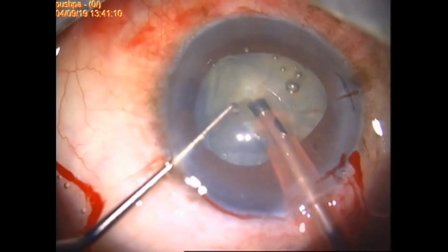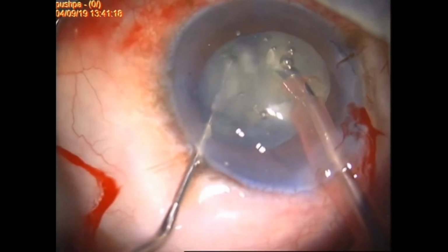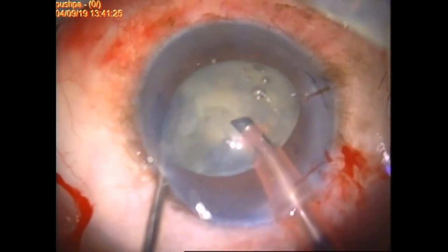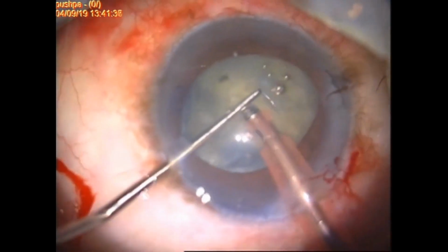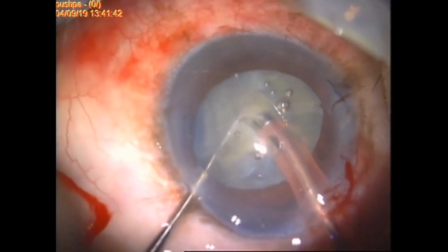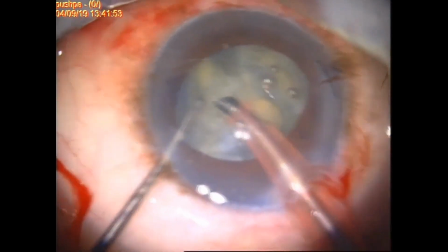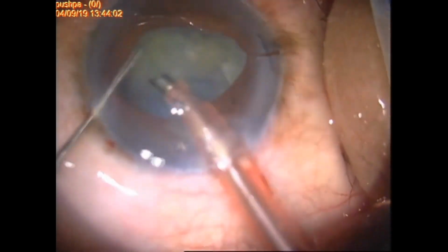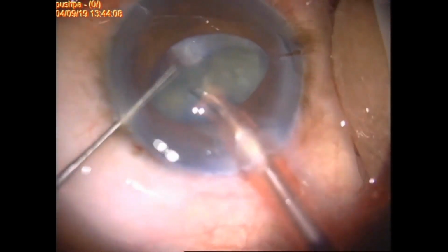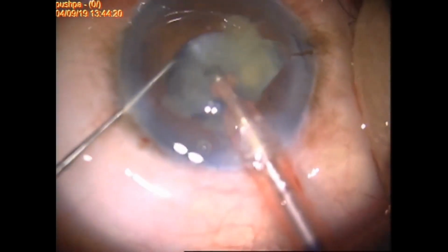This is a fast forwarded video of stop and chop Phaco with parameters comprising vacuum of 400 mm of mercury, aspiration flow rate of 26 ml per minute, and the bottle height was 80 cm. Nucleus management was done within the bag. Quadrant was also emulsified within the bag, with a few quadrants emulsified in the supracapsular plane. Quadrant removal was also managed meticulously with the reduction of Phaco parameters.